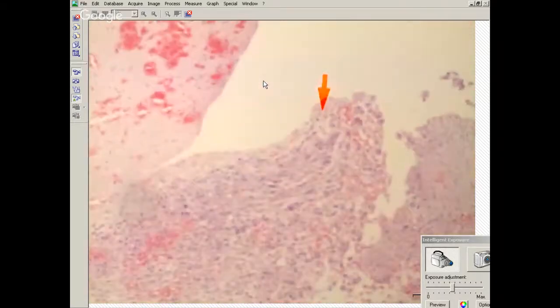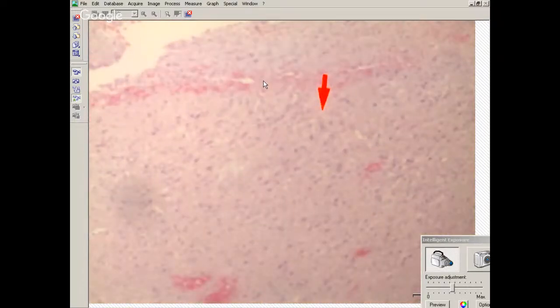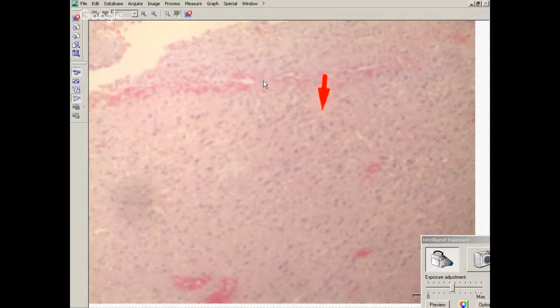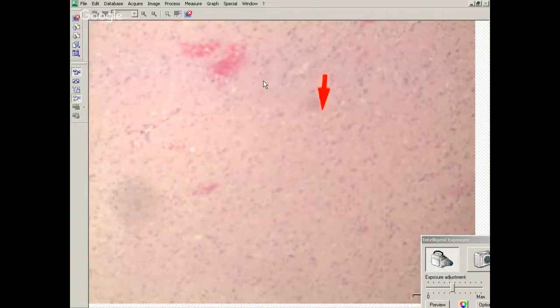So, Dr. Fowkes. Yeah. So then the secondary GBMs will have a different phenotype? Yeah, so secondary GBMs start from a low-grade tumor. So typically, secondary GBMs are going to have an IDH mutation. So IDH mutant, meaning that the cells stain with the IDH1 R132H. And the ATRX is going to be lost. It's going to be mutated. So staining for ATRX is wild type. Mutant ATRX is loss of staining.